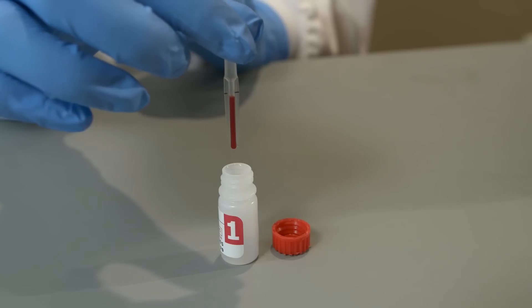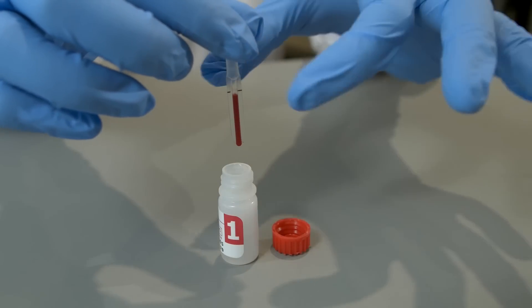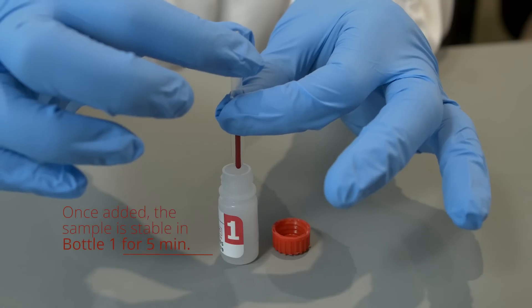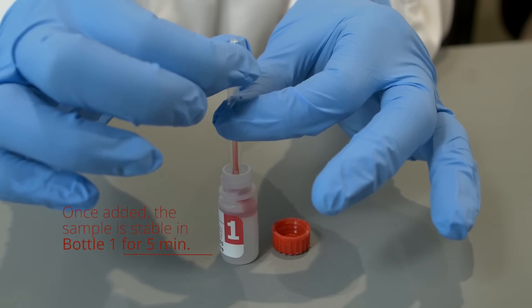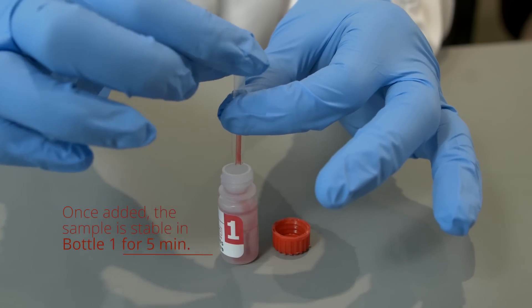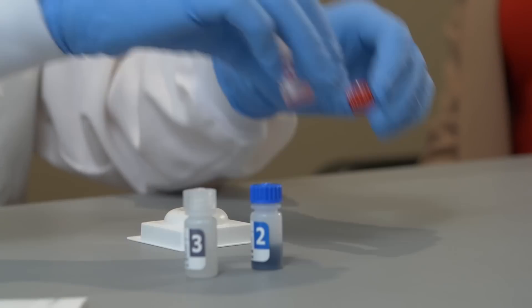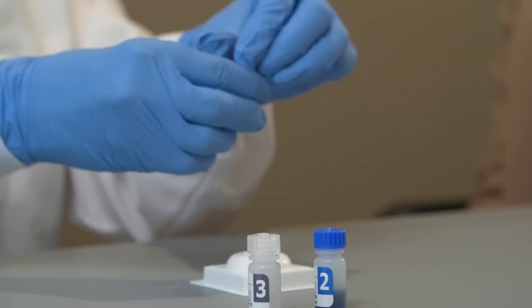However, if squeezing the bulb does not expel the blood sample into bottle number one, cover the pinhole with gloved fingers and squeeze the bulb again. This should release the sample from the pipette stem. Once the sample has been transferred into bottle number one, the sample diluent, recap the bottle and mix well by inversion.